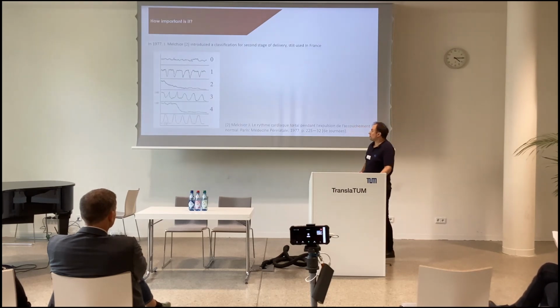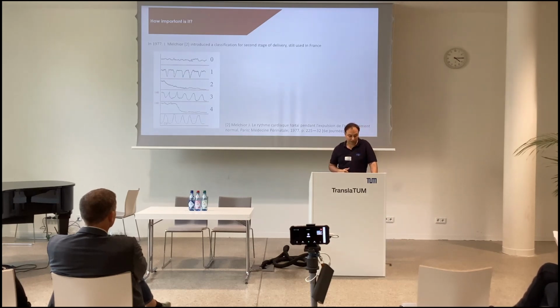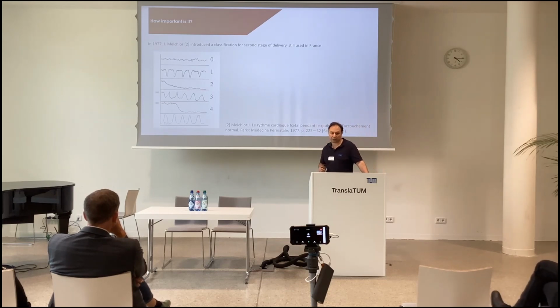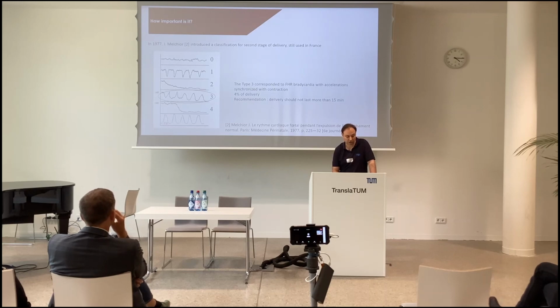So, how important is the problem in the current clinical routine? In France, we use the Melchior classification for the second stage of delivery, which consists of 4 possible patterns. And this was proposed a long time ago, before there were MHR sensors.